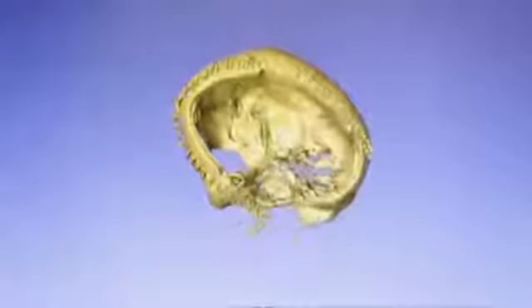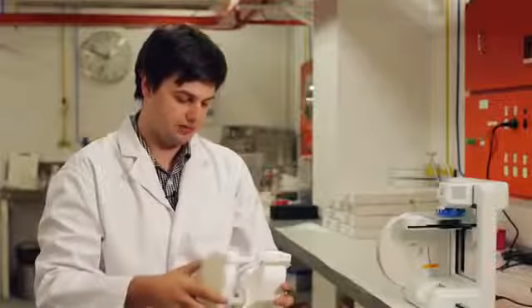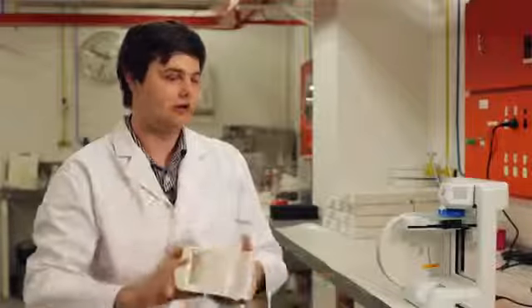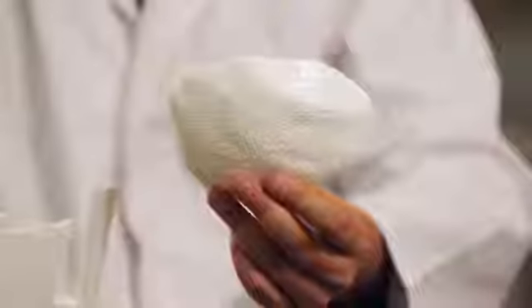In order to produce this mould, first we take the CT scans of the patient and we use these imaging to create a 3D model of the skull. We then use this to create a two-part template. We then provide this template to the surgeon who, during the surgical procedure, will place bone cement within the mould, compress it, like that, allow it to cure, and afterwards we are left with a patient-specific implant.